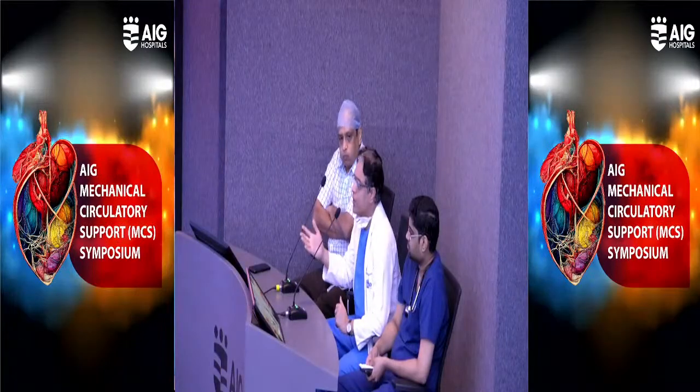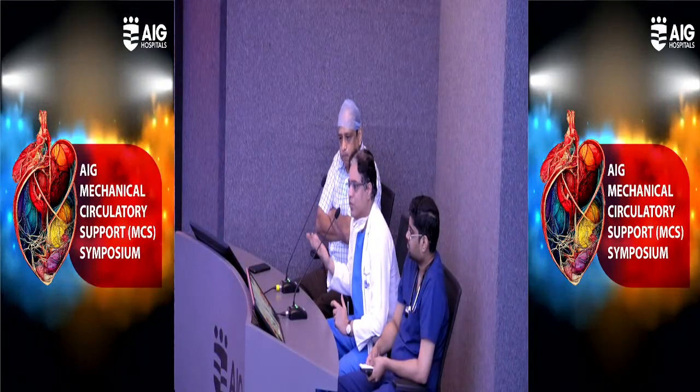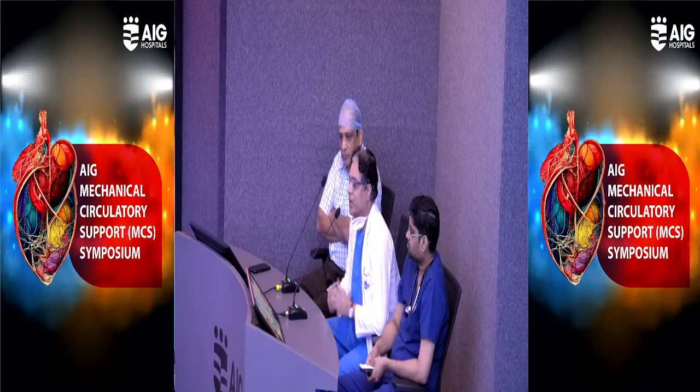So suppose you have a stable patient and you are planning high risk PCI, here comes the role of hemodynamics. You do the right heart study, understand the wedge pressure, simply look at the mean wedge pressure. If the mean pressure is more than 70, clinically the patient is stable, wedge is optimal, and you are not planning an extreme high risk procedure, what I mean is not extensive rota ablation and all, this group of patients do as well with the IABP, with the support which is provided of around 1 liter.